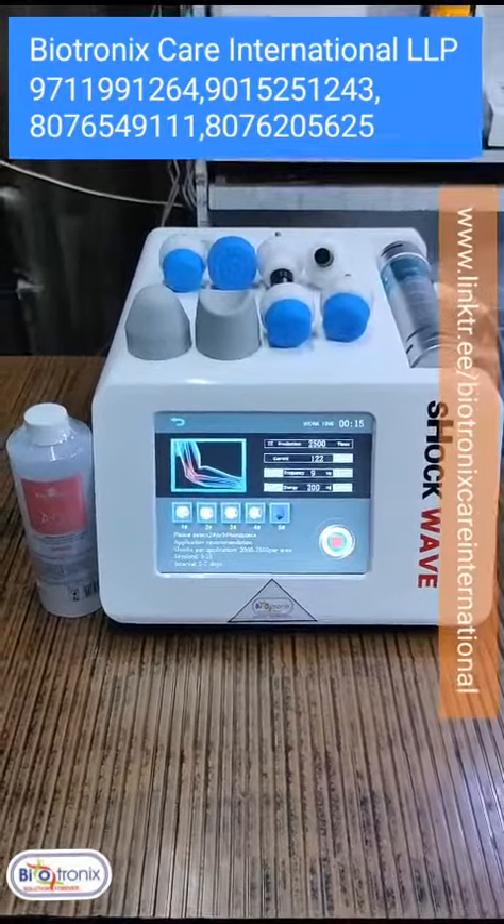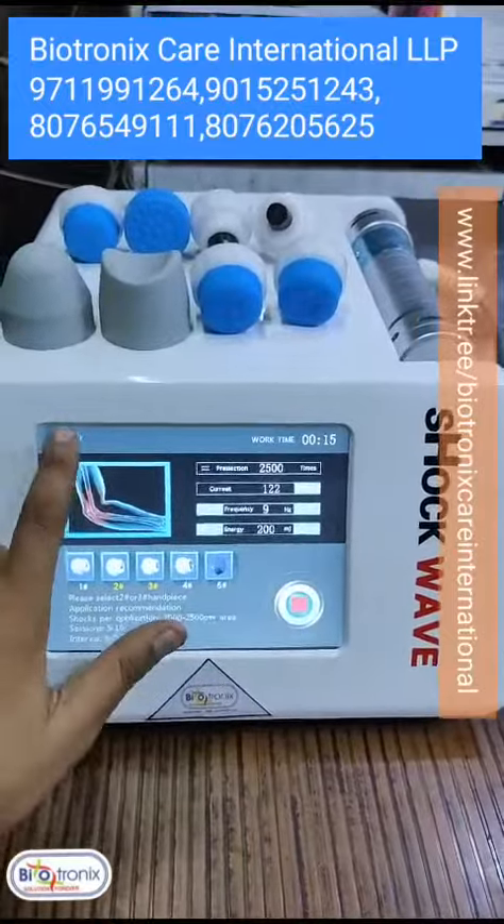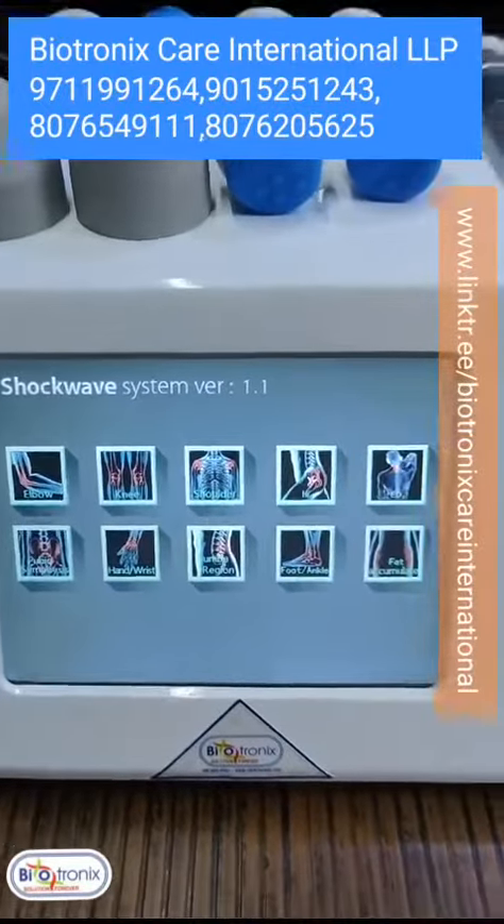This is the electronics electromagnetic shockwave. These are all the features: elbow, knee, shoulder.